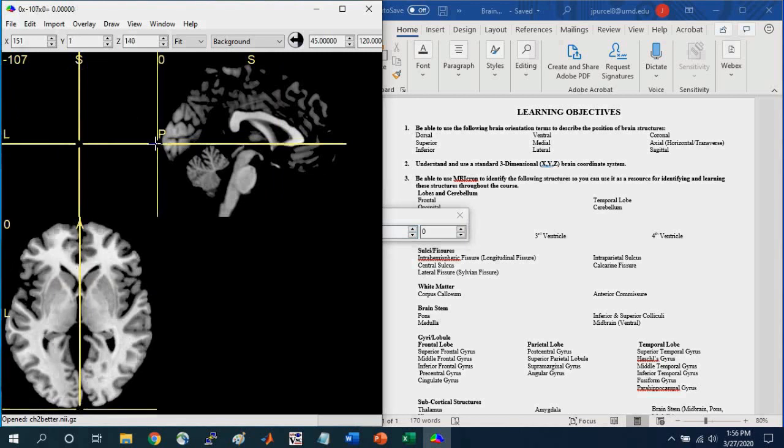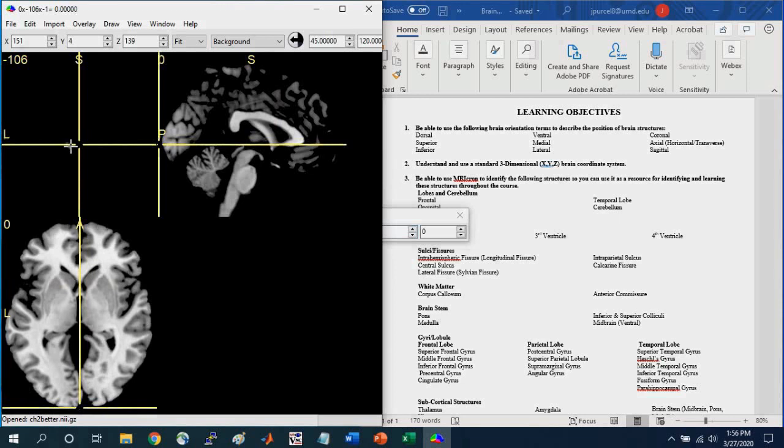And so this is the very, very back. So you're barely seeing any, just a tiny bit here in the coronal slice. And that's a negative 106. So from the origin, all the way to the back is 106 millimeters, okay?